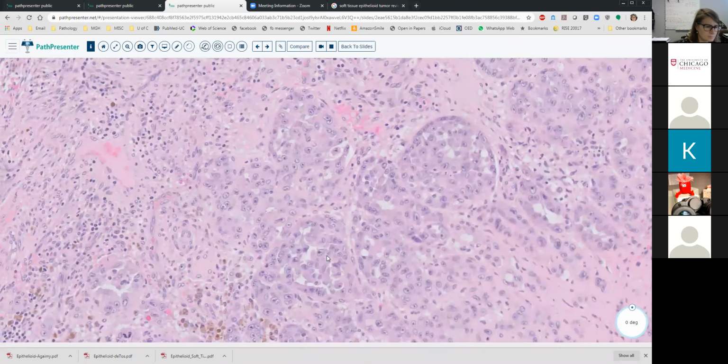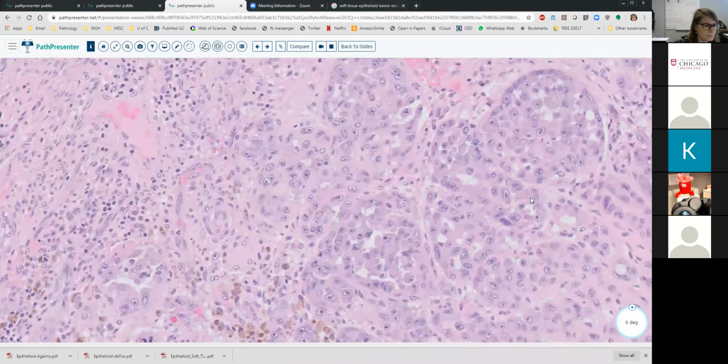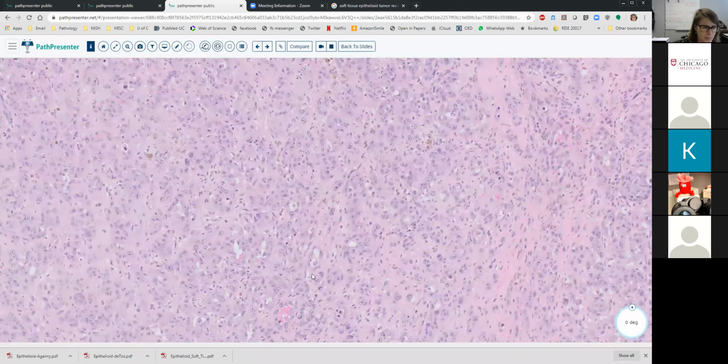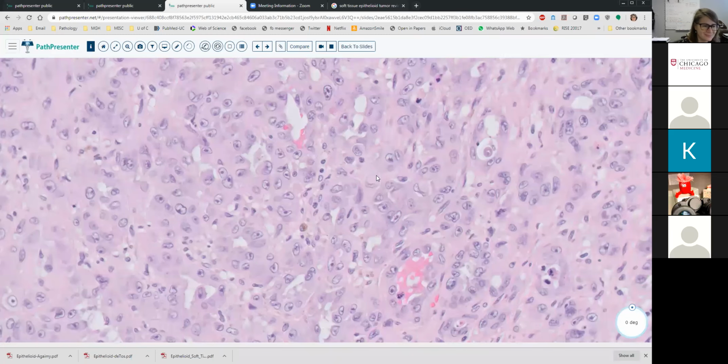And cytoplasm, I missed cytoplasm. So it's not myxoid. It still looks pinkish, and because we are in the epithelioid version, it does look epithelioid. So I think it is where it is supposed to be.